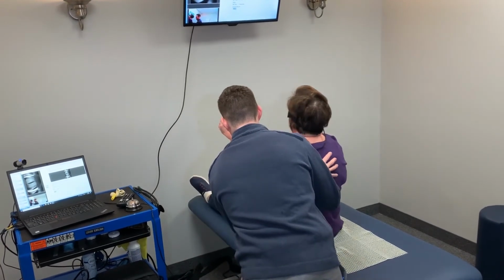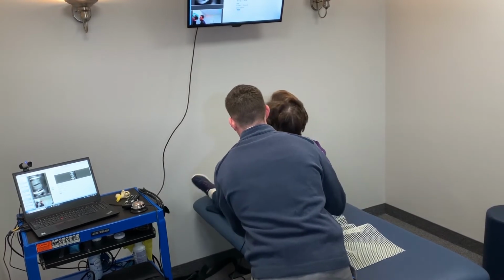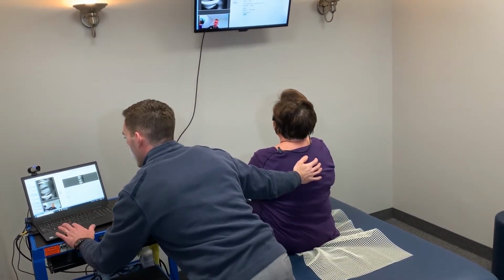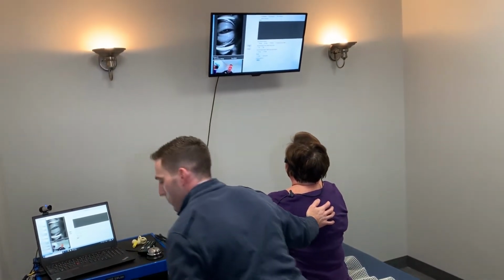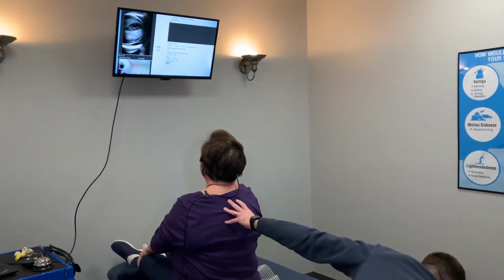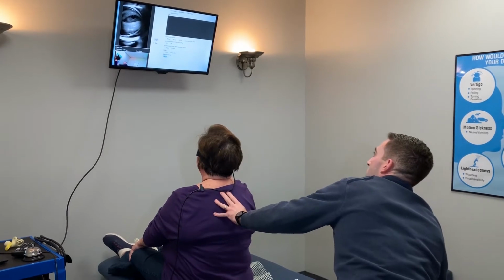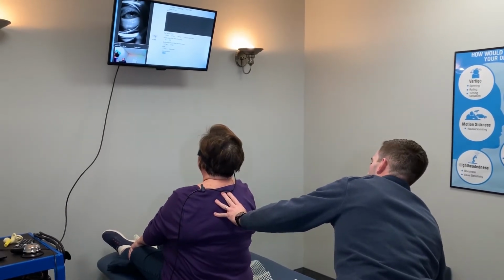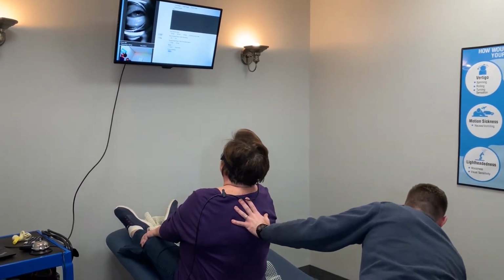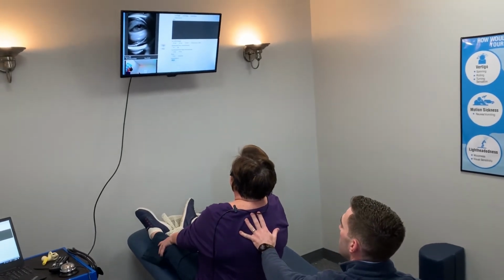So what I'm going to do is go ahead and bring your feet up onto this table here. Good. And scoot your hip right over to your left hand side here, Pat. Just a little bit more, perfect, just like that. Now what we want to see is that eye beat in an upward motion once we get her to lean back here in a second. And then we're going to slip the goggles off, Pat. You will probably get a little bit dizzy, okay? And it'll just be for a few seconds like it was before.